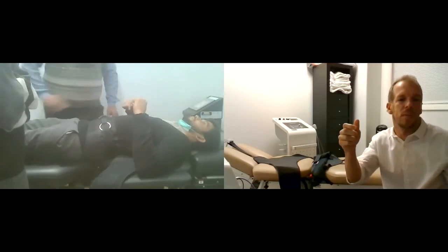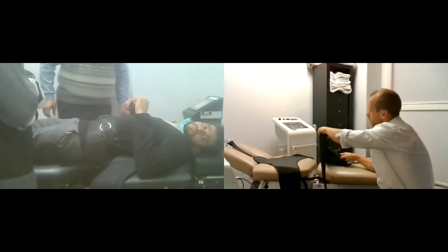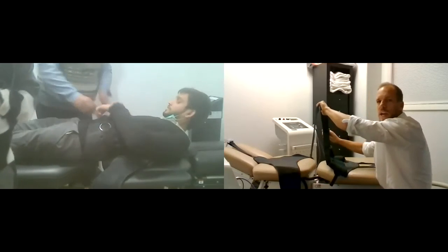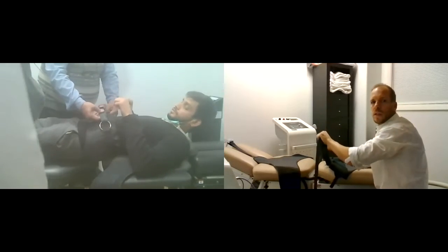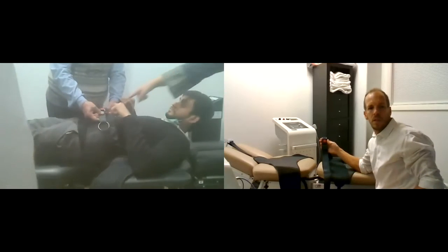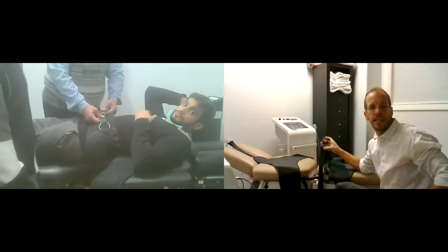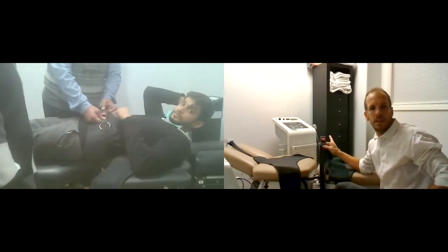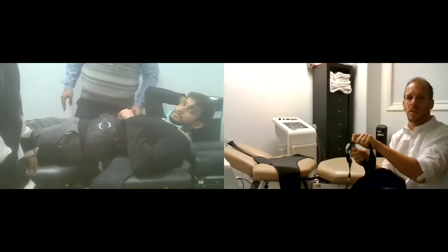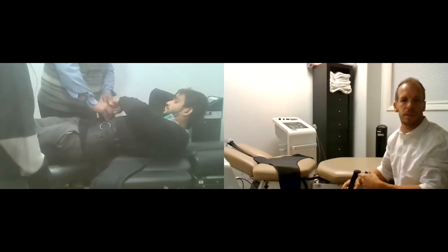No. So grab with your right hand, doctor. With your right hand, grab here before it goes into this buckle here, and then with your left hand, grab the loose end. Okay. No. Close it. Go ahead and keep it closed. Yeah. Go ahead and click it. Click it tight. Okay. There. Now feed with your right so you're feeding with your right as you're pulling with your left before it goes into this buckle.